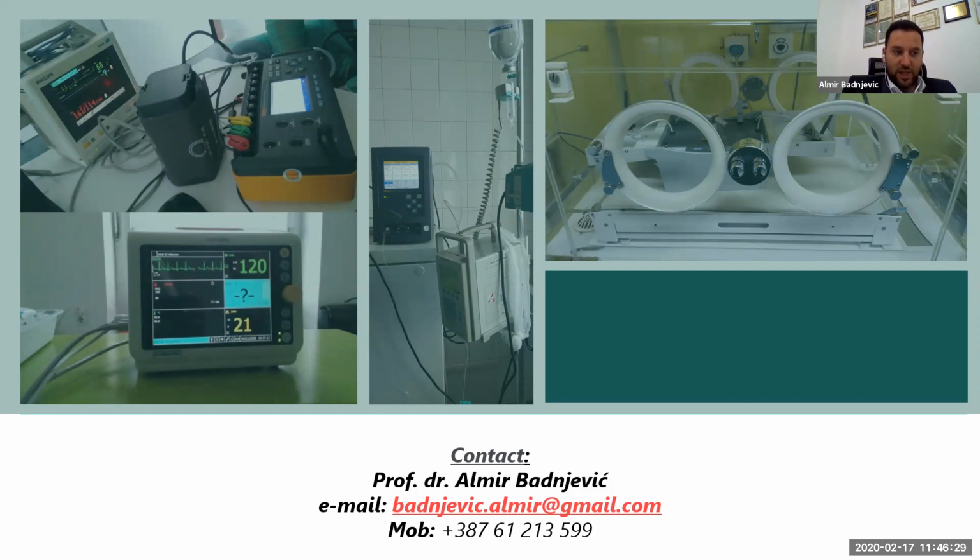On inspection and on verification, there is no touching of that kind of devices. You are just measuring the output parameter. So you are measuring, in fact, what is happening with your device, what your device is giving directly to the patient. For example, here is the question: what are you doing for mechanical ventilators? For the mechanical ventilators, the most important terms which go directly to the patient are, in fact, the volume and the oxygen concentration. On different kinds of ventilators, there is no volume. There is, in fact, the pressure or the flow, etc., etc.